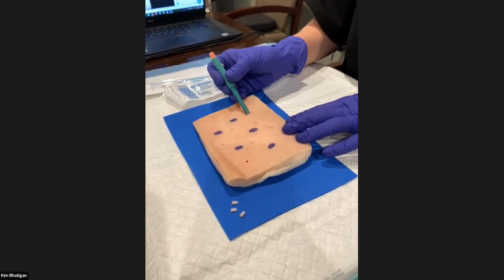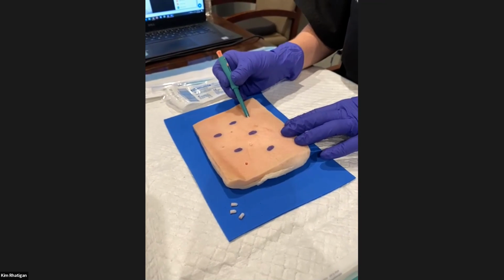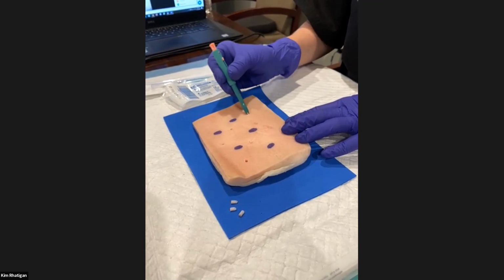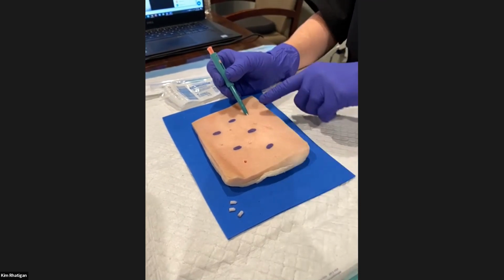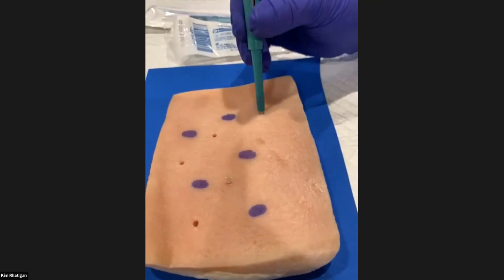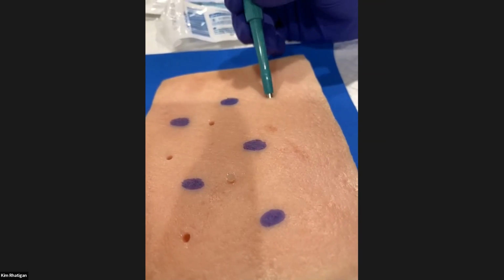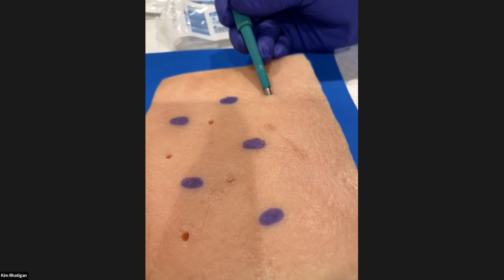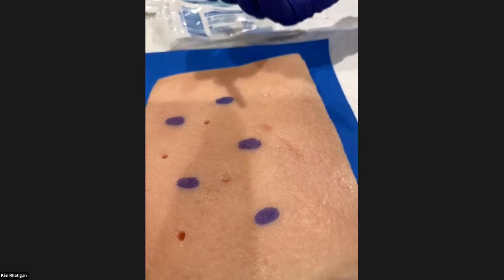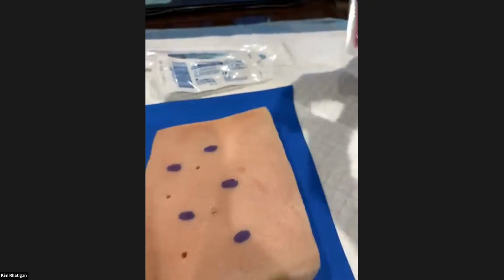Okay, you're going down. Go ahead. The key here is to leave some room before you hit the skin with the hub. So you want to zero in on that, Devin, so they can see I got a little space between the hub and the green part. All right, I'm going to pull this out. And he got stuck also. I think my punch is a little dull now. Okay. Try a couple more.